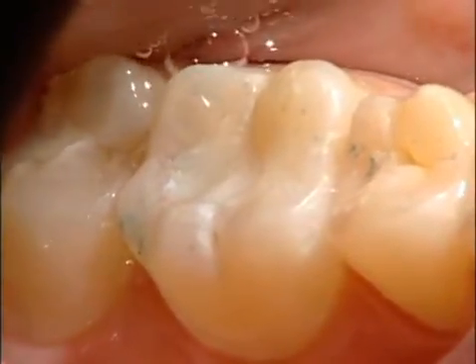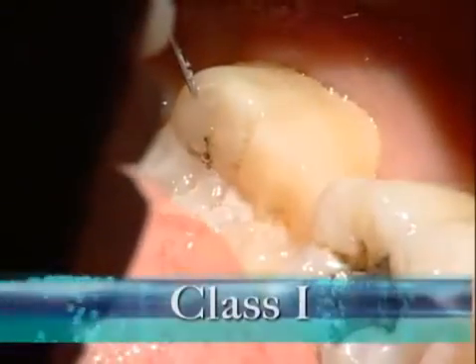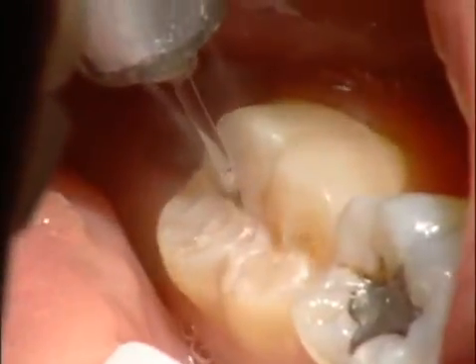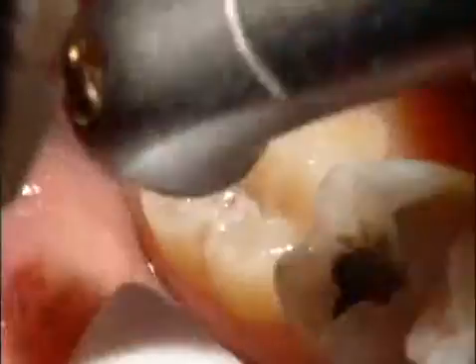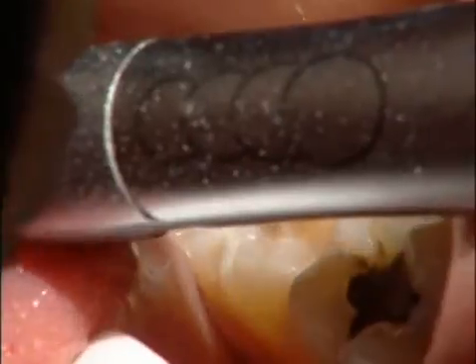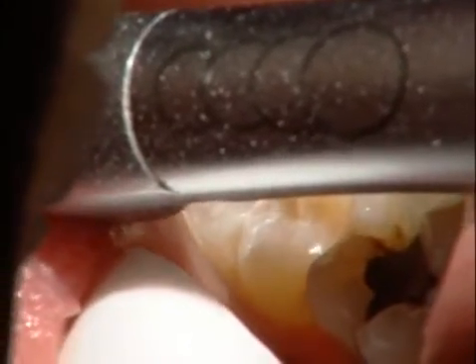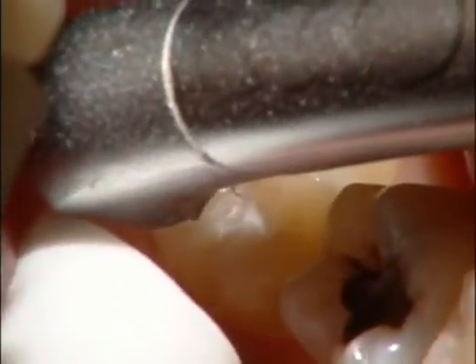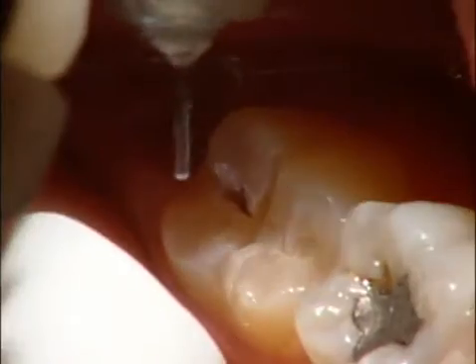So again, for the most efficient cutting, you want to be perpendicular to the occlusal surface of the tooth. If you are parallel, you'll find sometimes you'll be a bit frustrated because it's slower than what you're used to with the drill. So if you get off the perpendicular, get as perpendicular as you can. And as you can see, I'm turning the handpiece, so I'm going to get perpendicular to the buccal surface, work down from the enamel into the dentin, then turn the handpiece toward the lingual, again working down the enamel into the dentin. Once you're into the dentin, through the occlusal surface, you can go back to parallel, and you'll have more rapid removal of the tooth structure.